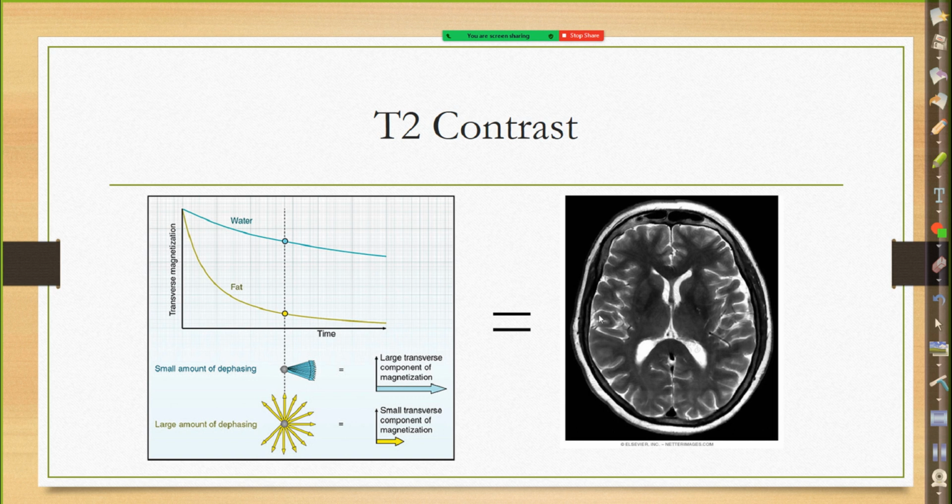So let's just, once again, identify where those areas of water are in the ventricles, the lateral ventricles. You also have them kind of right here in the grooves of the brain, as it surrounds the entire brain. This right here is subcutaneous fat. It is still bright. But once again, that's due to a concept called J coupling, but we'll get to that. But just remember, this is not as bright as our CSF.